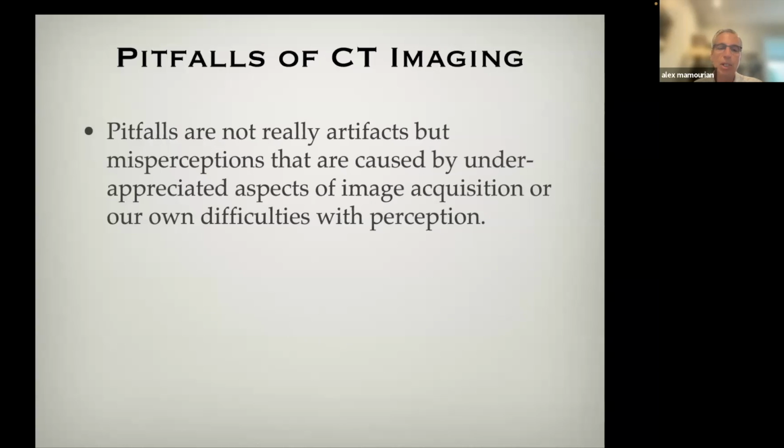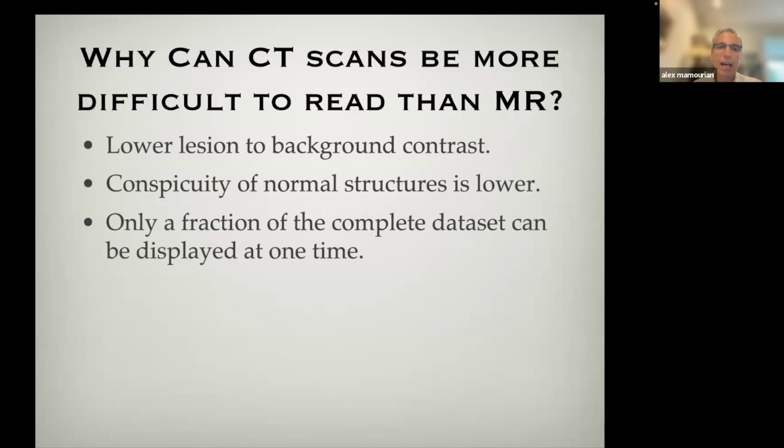And on CT imaging, there are some specific pitfalls that I think you're probably aware of, but we'll go through a little bit. Personally, I think CT scans are more difficult to interpret than MR scans. On MR scans, usually the findings are pretty evident, and the interpretation is often the problem. On CT, the problem for many readers is not so much the interpretation, which can also be a problem, but detection. The actual detection of the abnormality is the challenge.